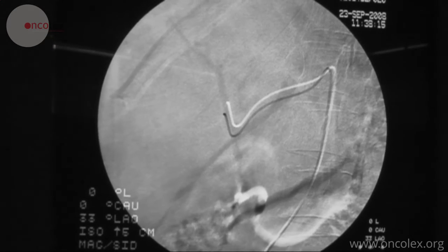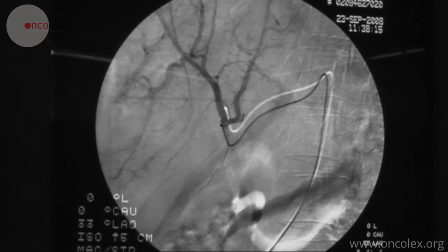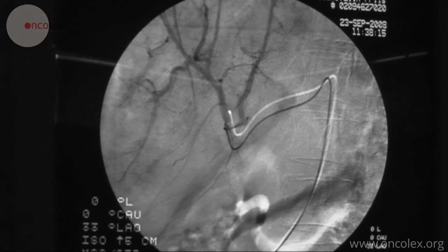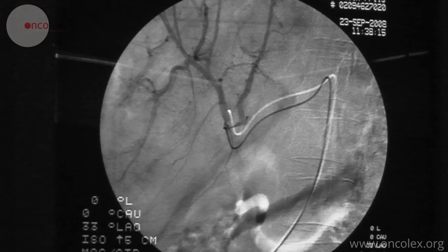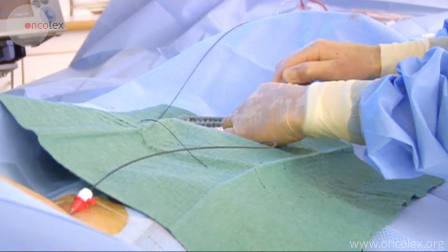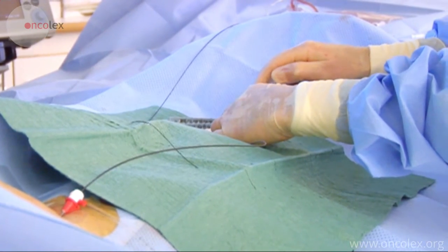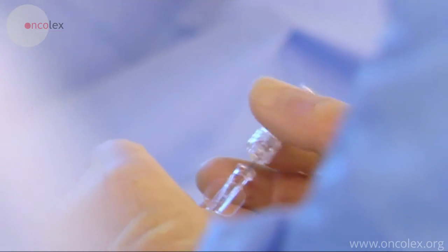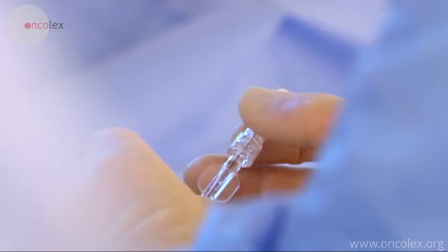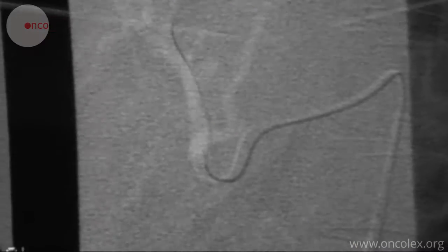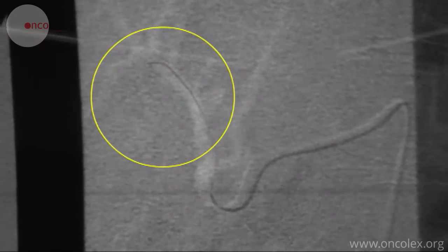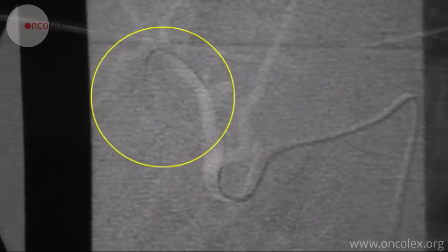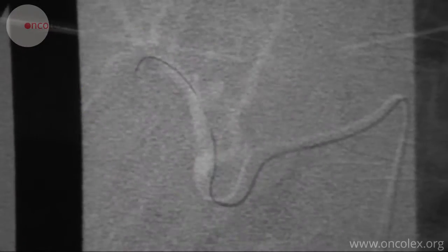Here, the catheter has reached the periphery of the hepatic artery and the radiologist chooses to go deeper into the segment arteries with a micro-catheter. A micro-catheter is inserted into the catheter. The embolization agent will be placed through this.